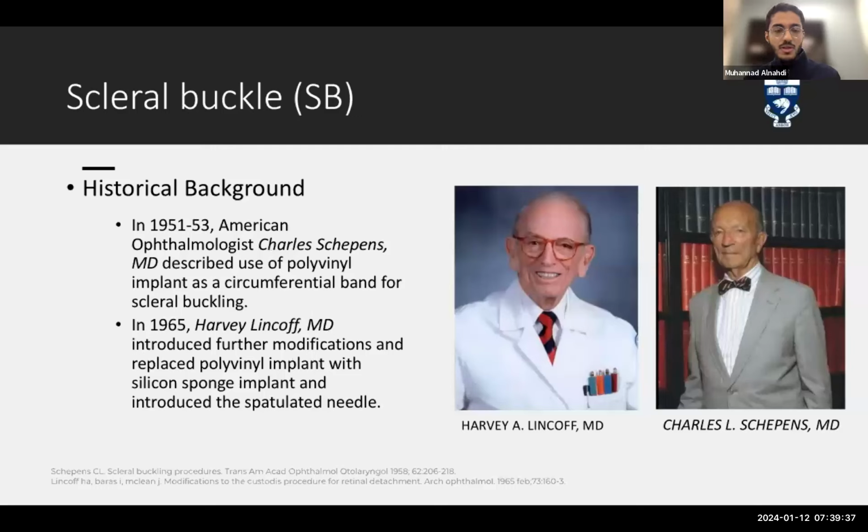There were a few other modifications in those same few years. The American ophthalmologist Charles Schepens was also involved in describing the scleral buckle, which for the first time used the circumferential band. Later on, Harvey Lincoff further improved the procedure by changing the implant material, mainly due to complications.